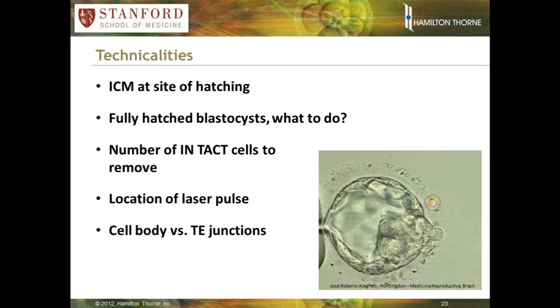If nothing else, it may denature the DNA in that cell. So it's important to recognize, when you are removing trophectoderm cells, the number of intact cells that you are removing. We may take a big chunk and stretch trophectoderm cells, but if we're firing all along the body of those cells, the cells that come out that have been fired on are not really going to be accessible to the probes for amplification, and hence you may have fewer cells than you think.